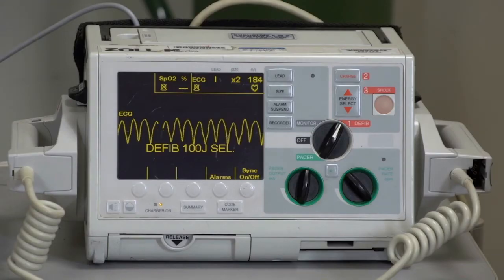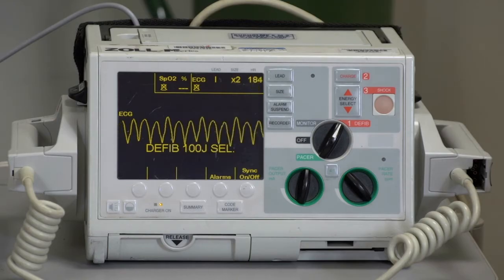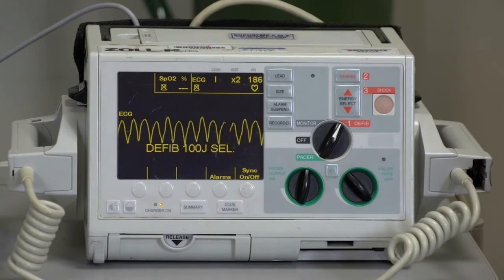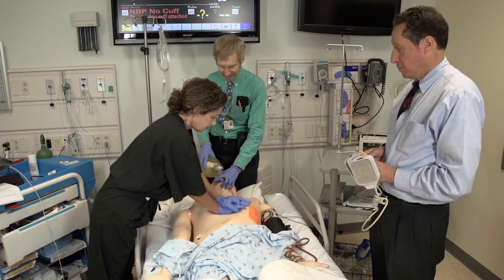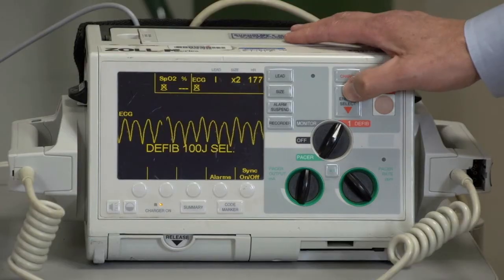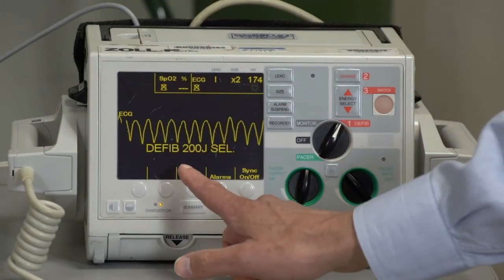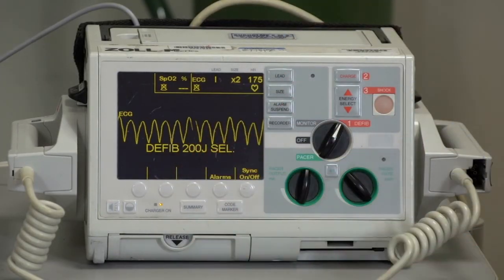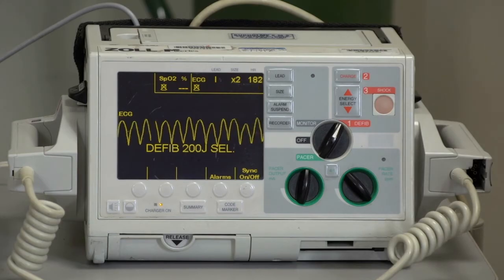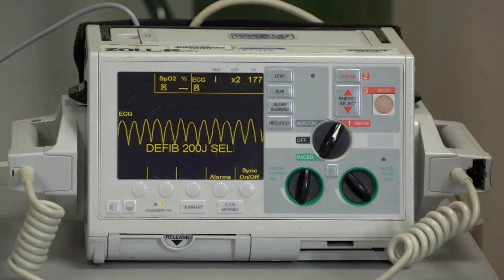With a manual defibrillator, you must first verify that the rhythm on the monitor shows ventricular tachycardia or ventricular fibrillation. Continue CPR while you select the appropriate current level. For a biphasic machine, use the manufacturer's recommended energy level or, if this information is not available, the maximum energy level. For a monophasic machine, use 360 joules.